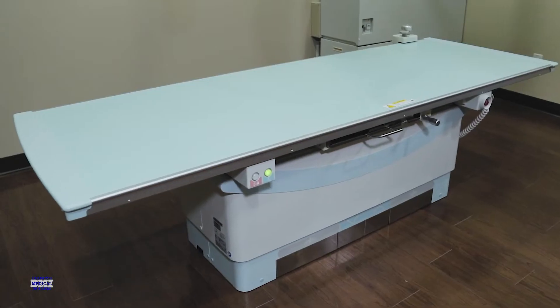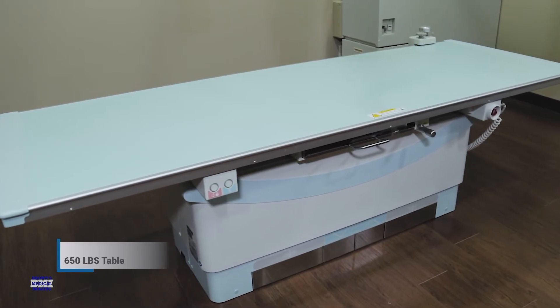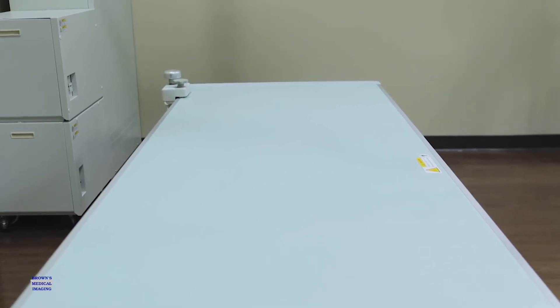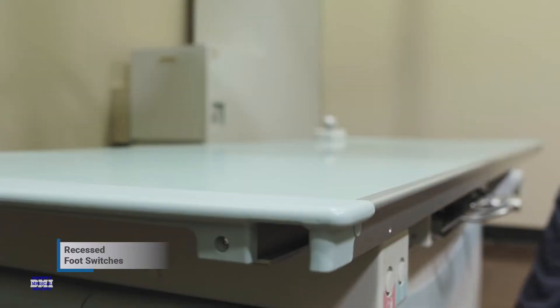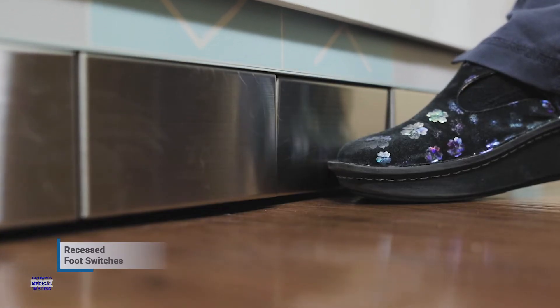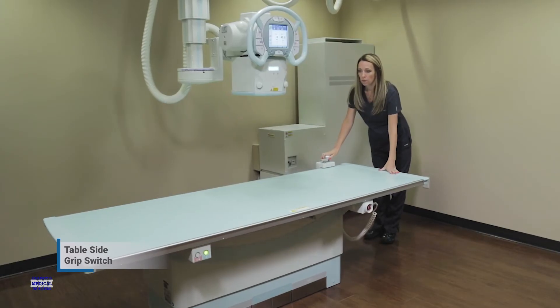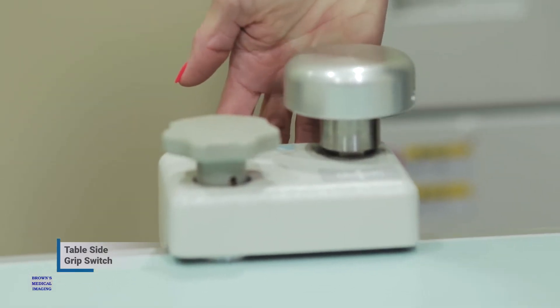The RadSpeed Pro comes complete with a durable 650-pound weight limit table. Shimatsu's smooth tabletop design allows for easily transferring patients from any cart or gurney. The recessed foot switches located at the base of the table ensure complete patient safety, as they prevent unintentional table movement while exiting the table. The table-side grip switch allows the technologist to manipulate the tabletop in all directions from the back side of the table, as well as lower and raise the table.